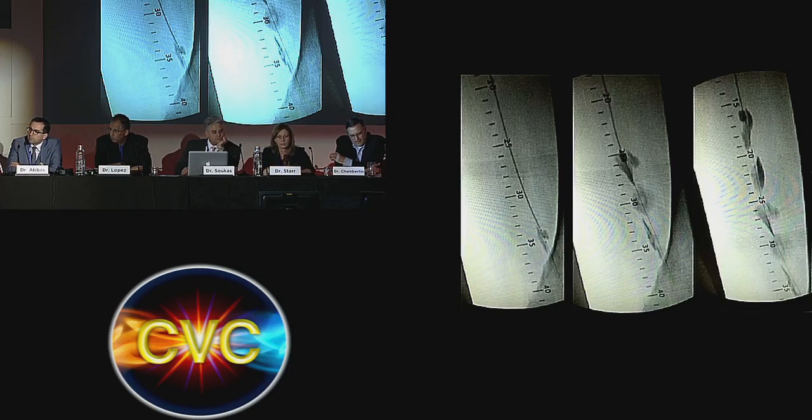Certainly the needle isn't super robust, so it has to do also with the calcification and the amount of penetration that you can get. But sometimes you can shy a little bit away from a calcified plaque, still get adequate penetration, and then the drug will diffuse retrogradely and antegradely to wherever that injection site is done.